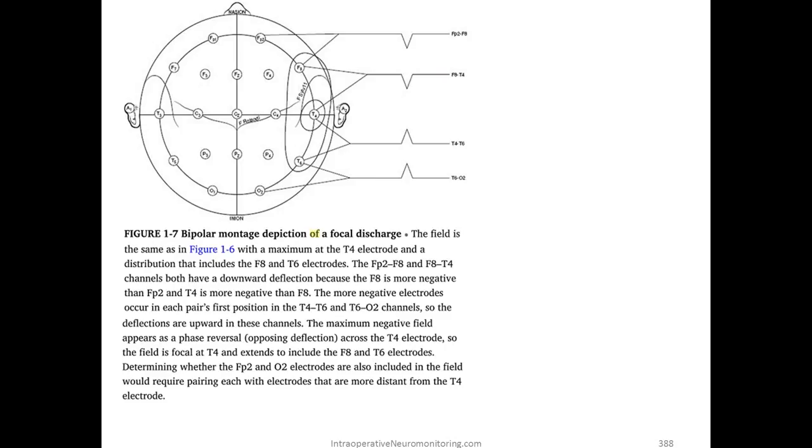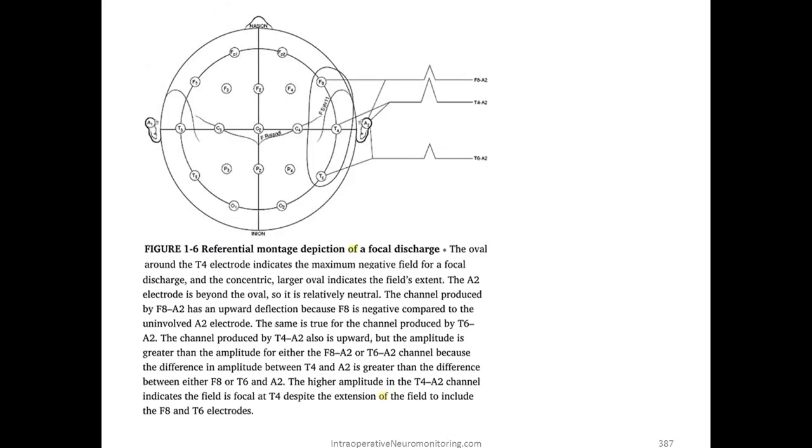So I was just thinking back to a couple slides ago, I believe I said referential had the phase reversal, where that's not correct. It should be the bipolar that has the phase reversal, as we see here. Referential has the increasing amplitude size.